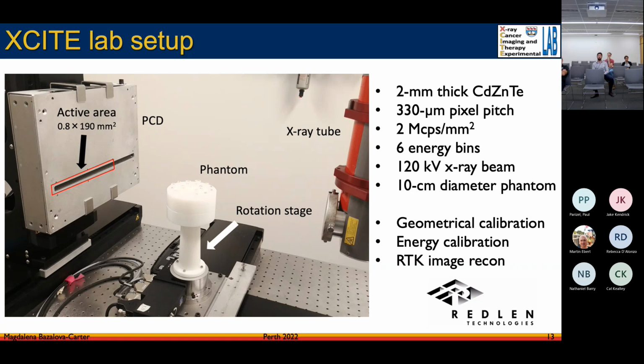So we are limited as to how large of an object we can scan, but it is much better than our first detector that was about 1 centimeter in length. So we had to do lots of crazy things to be able to actually scan with CT.